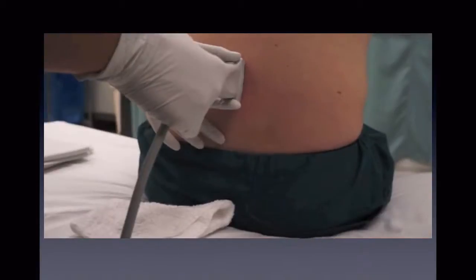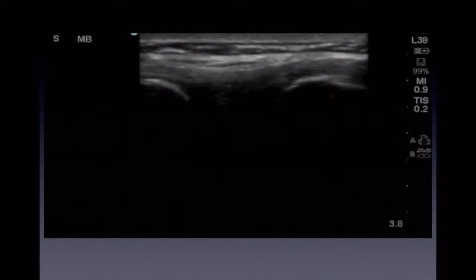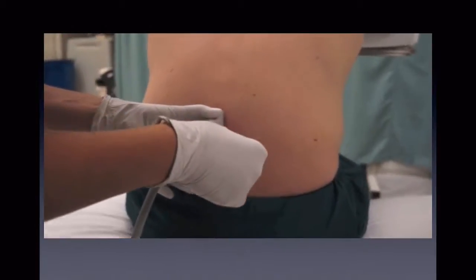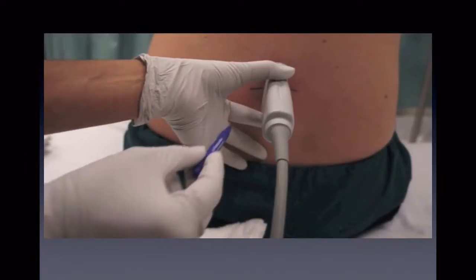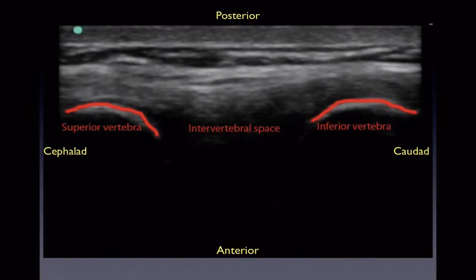Next, place your probe in the midline sagittal plane along your vertical crosshairs. Visualize the interspinous space between the spinous processes, making sure this is in the middle of your screen. Now you can again mark the skin on each side of the middle of the probe. Here we can see the interspinous space between the two hyperechoic spinous processes. The indicator is pointed cephalad as indicated by the blue dot in the upper left-hand of the screen. The interspinous space is seen between the spinous processes as marked.